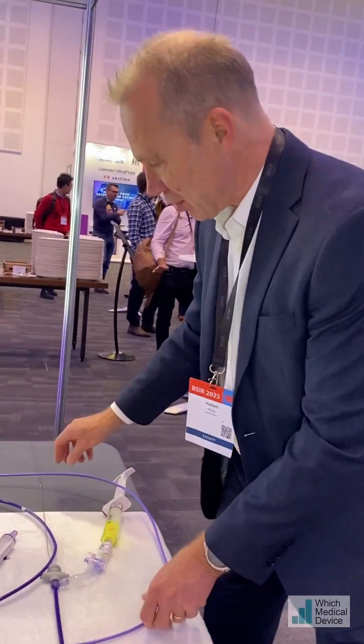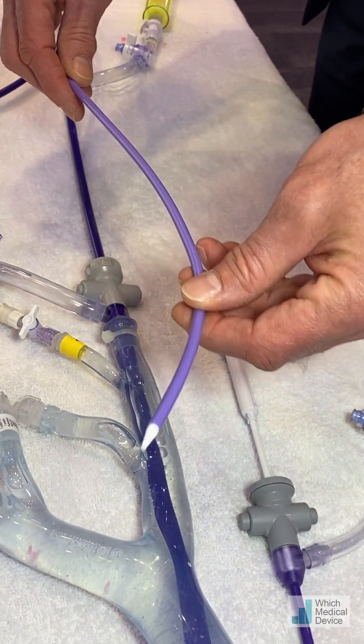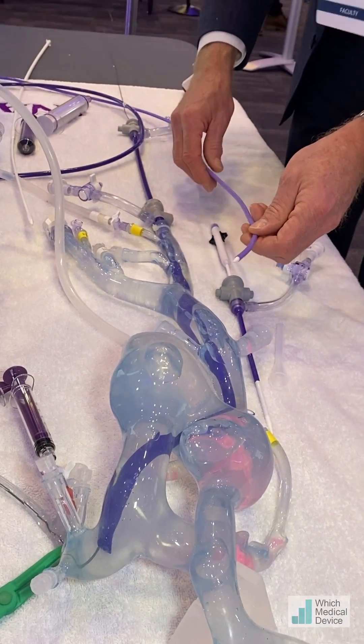If that's the case, what we can do is put it in over the 16 French one first, which because it's more flexible will track a lot easier. And once that's around, you can then insert the 24 French device over that.